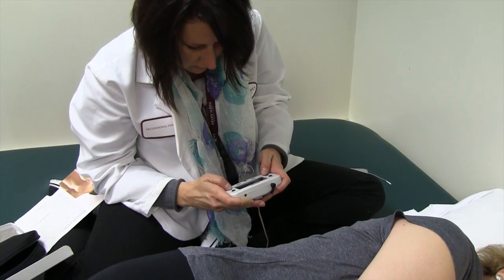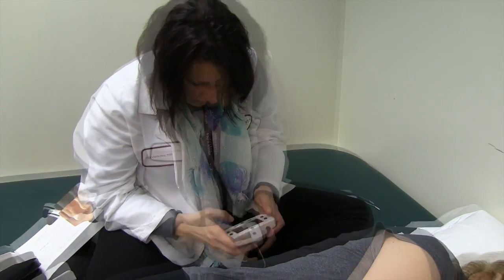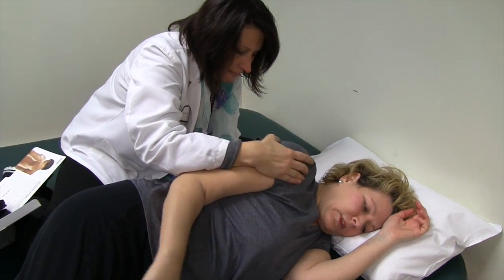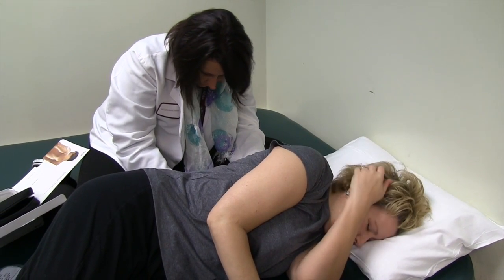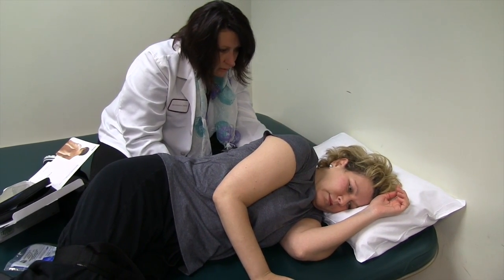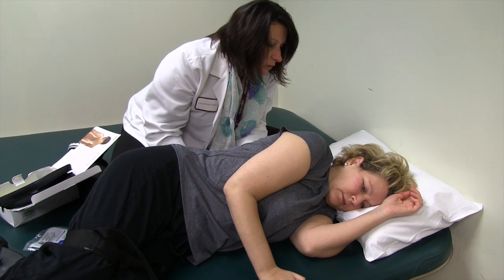I'm just programming your stim right now. Ready? I'm going to press the stim back here. What I'm looking for is it's going to pull your shoulder blade back like this with me. Start your arm here so I can feel these muscles kick in. Usually the first time we do some stim on you we don't get much of a contraction, but with practice you do tend to get a better contraction. Let me know as I'm going up — I'm feeling for a contraction, but if it gets too painful, tell me.